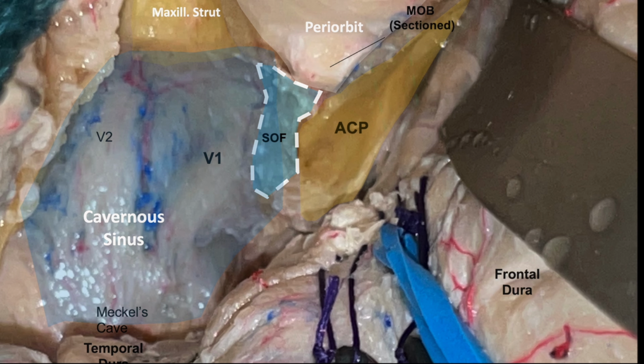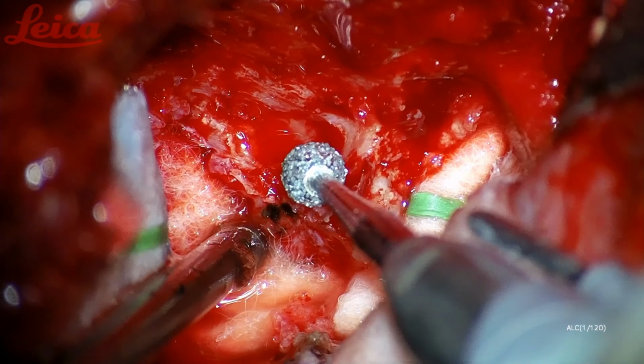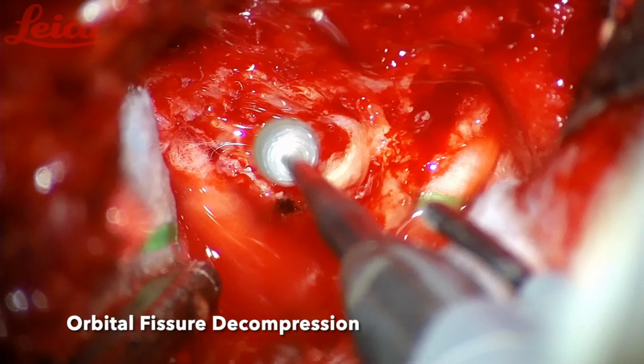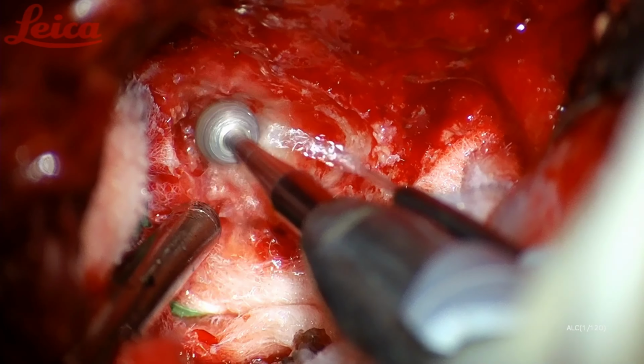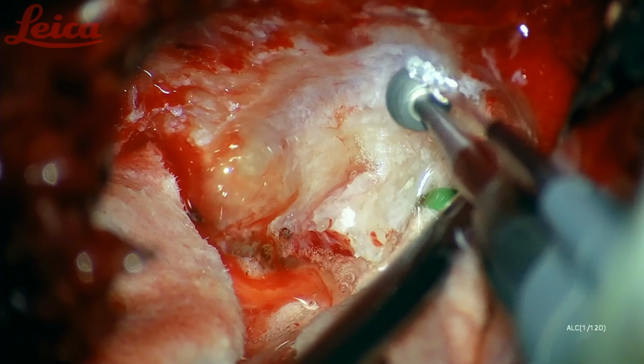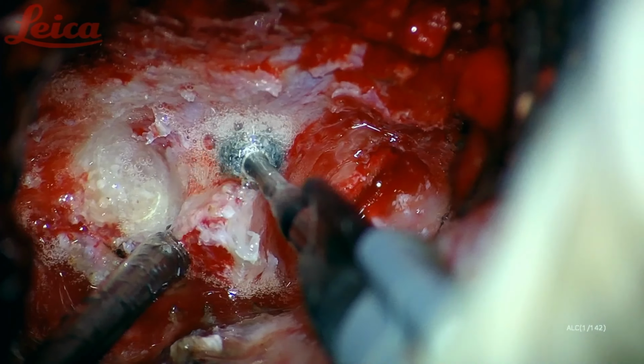At this point, we proceed with the decompression of the bony layer at the different points of compromise. First, the superior orbital fissure. Drilling is performed with a 3 mm diamond drill that will help to achieve hemostasis of the infiltrated bone. Special care needs to be taken to avoid damage of the periorbita.